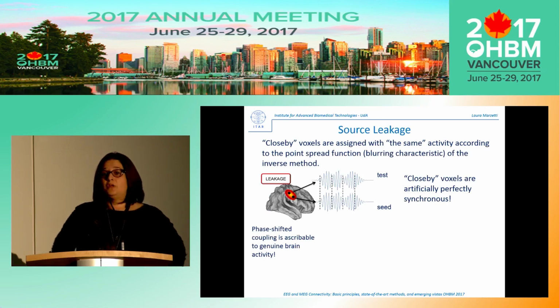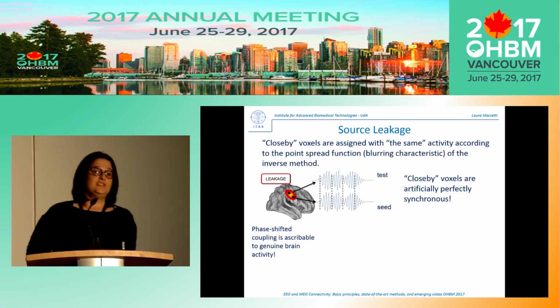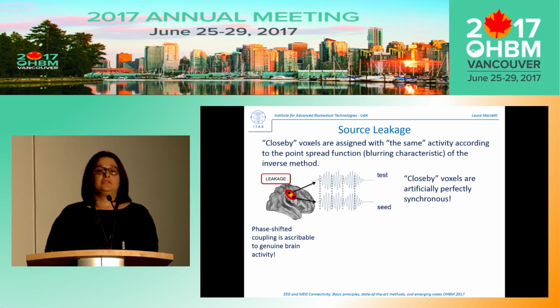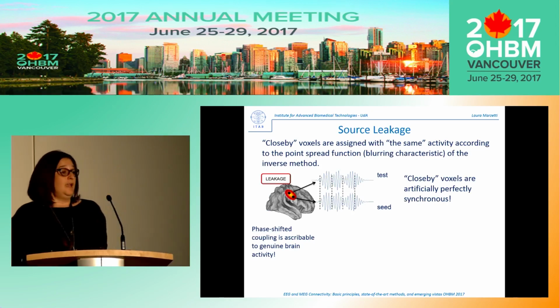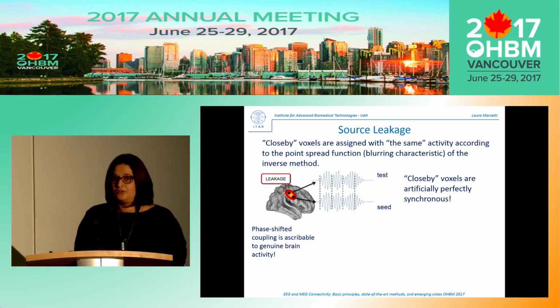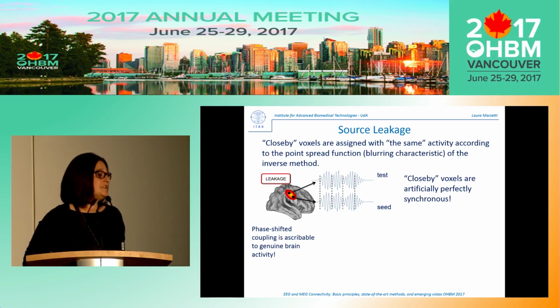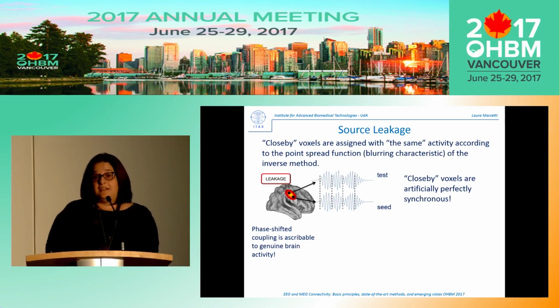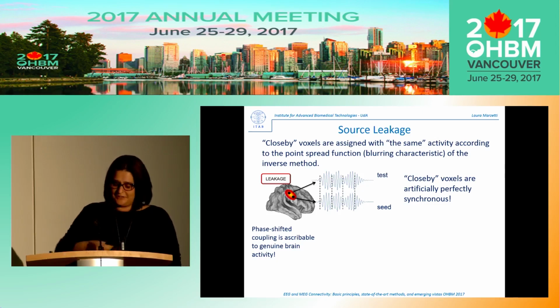Okay, so we are happy. We use our MEG signal with its high temporal resolution, not the amplitude envelope. And we use this kind of approach which directly tells us if two sources are phase coupled or not. But still, of course, we have the problem of source leakage and field spread, which is solved here in a very similar way to what was done before for the amplitude correlation. So the idea is, again, to throw away what is synchronous.